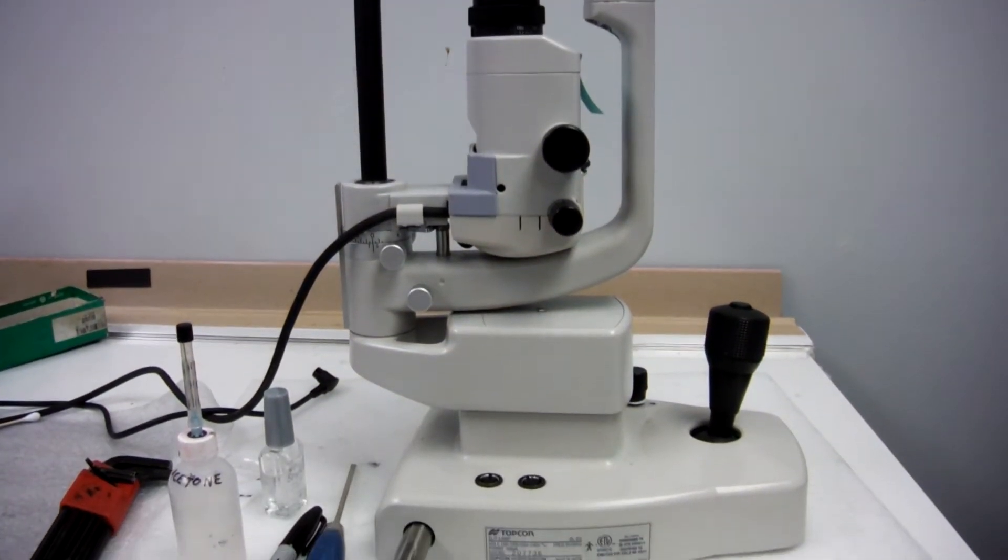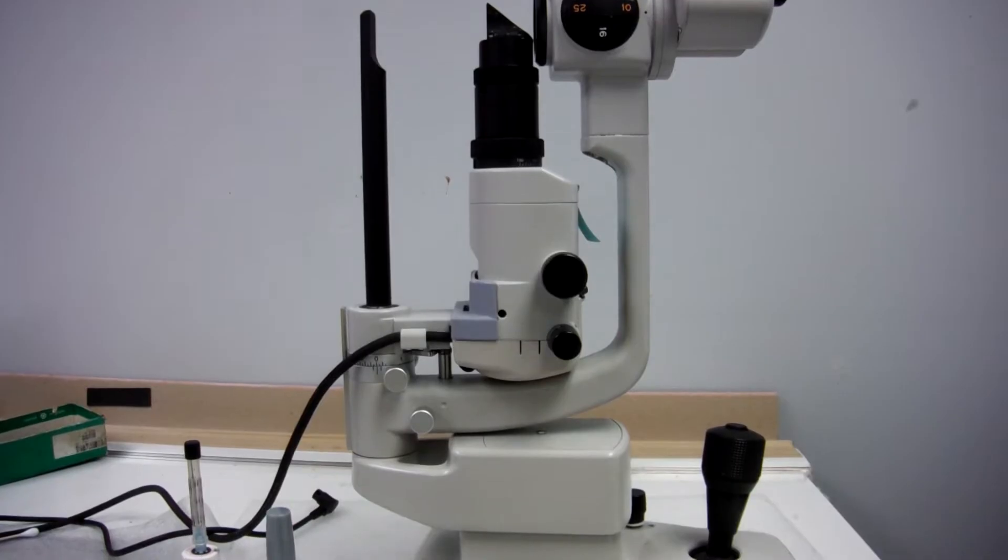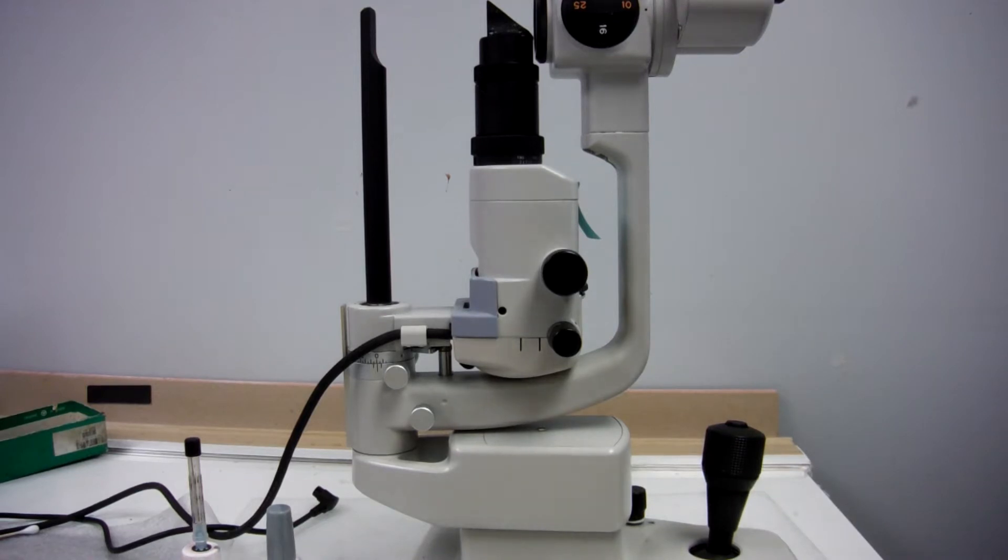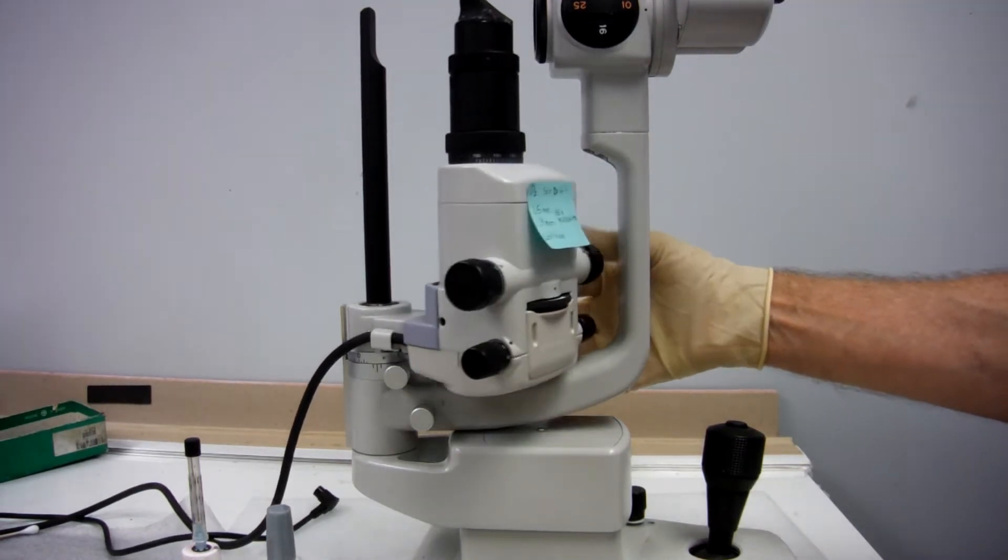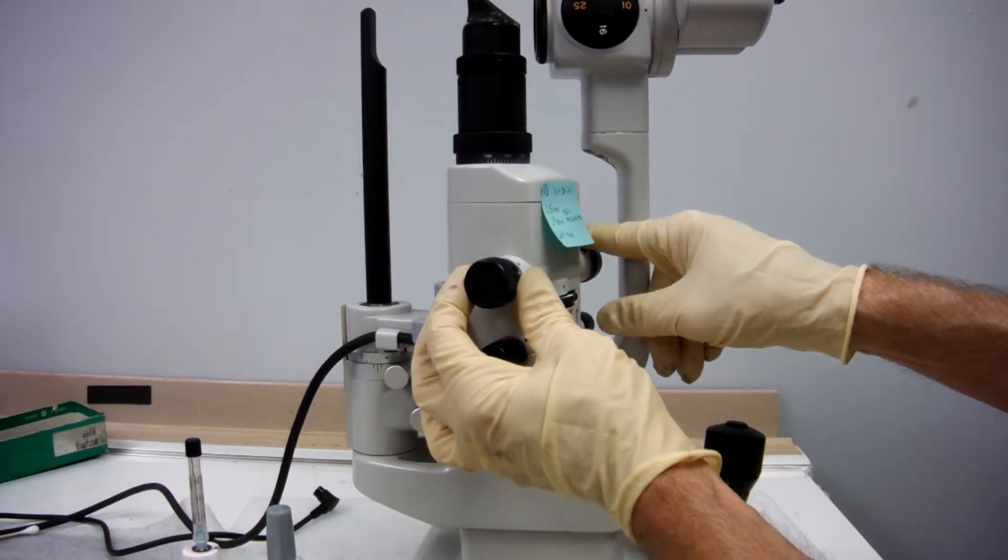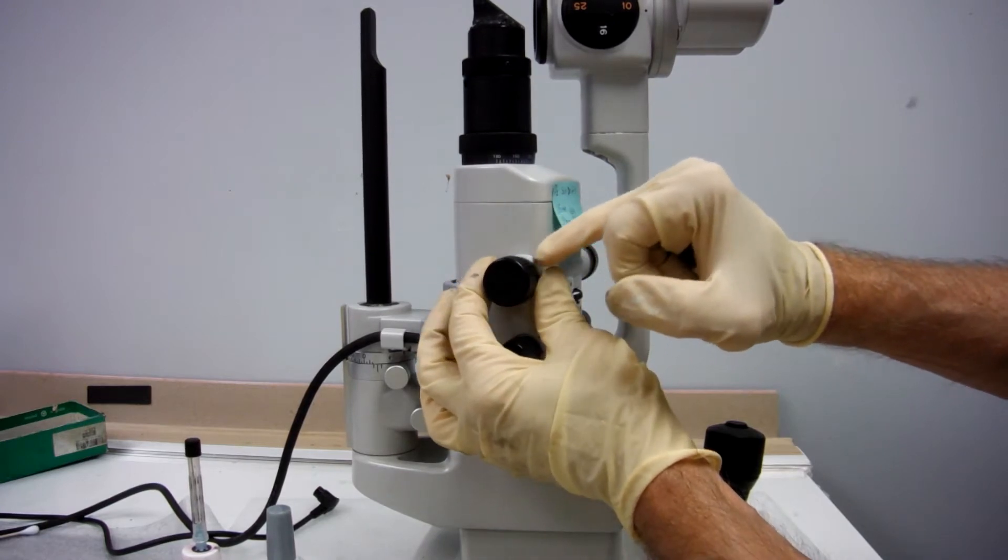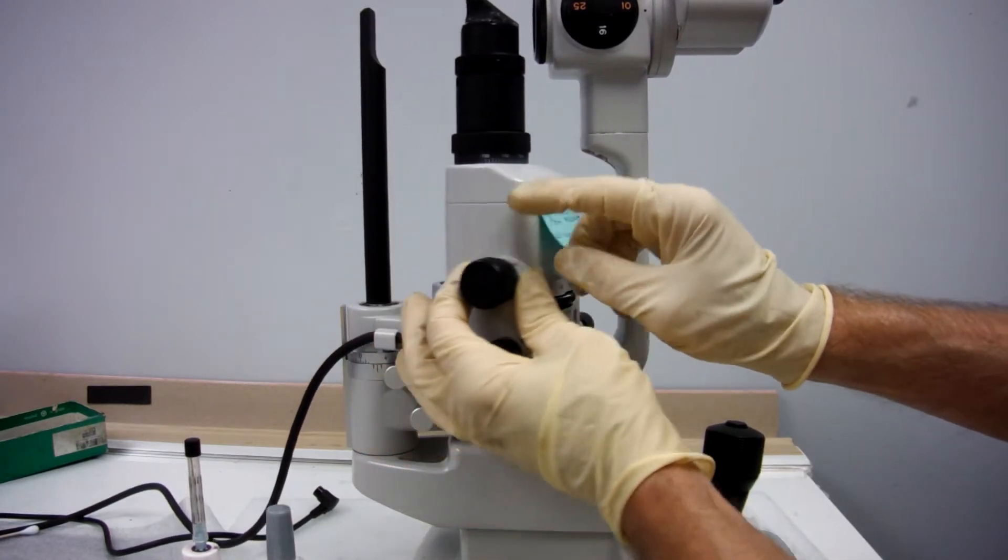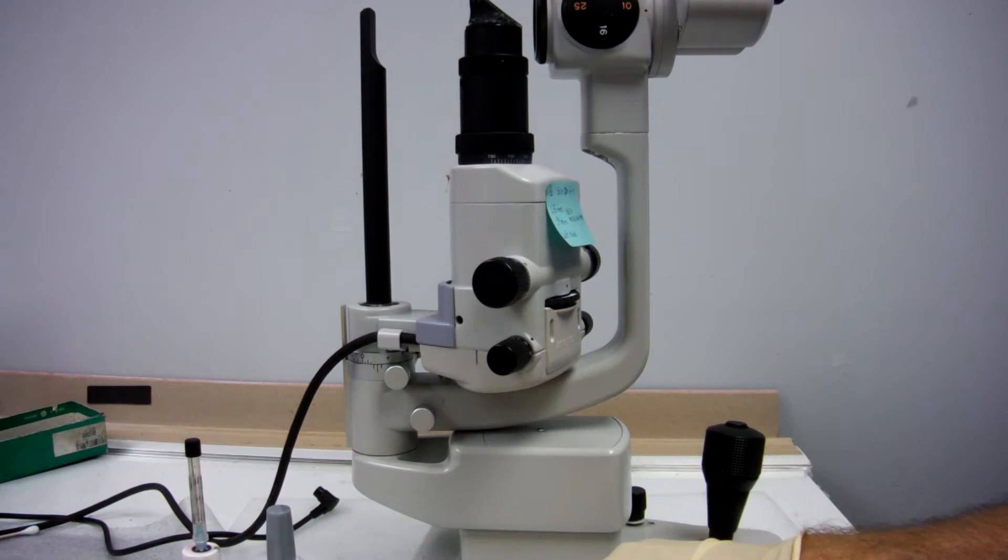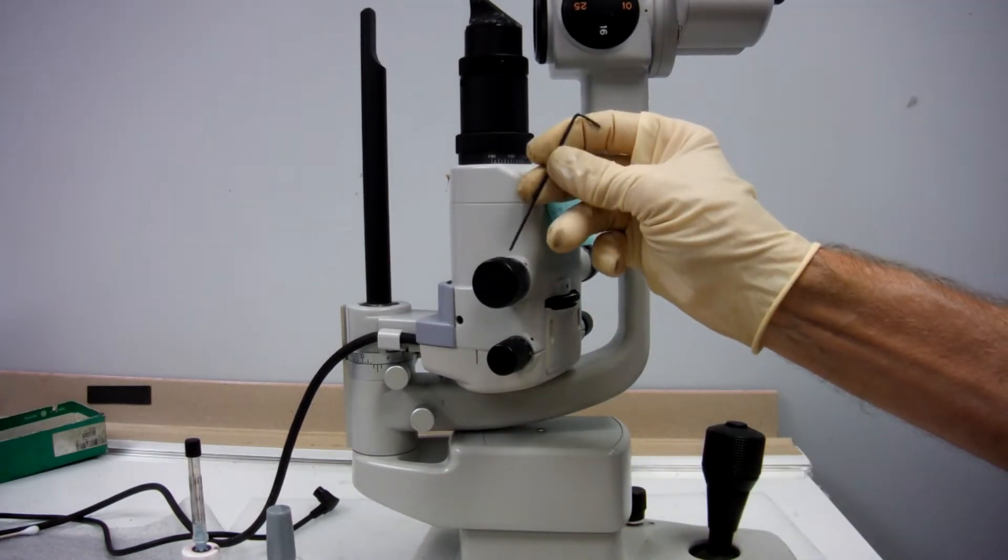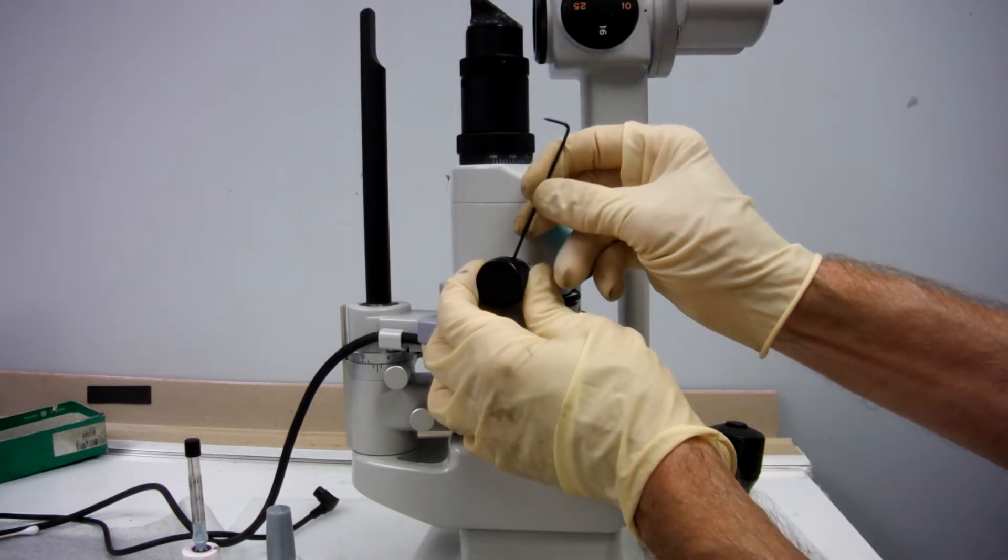On the D2 Slit Lamp, to tighten the drift of the slit, you would take off this left knob, right here, with a 1.5mm Allen.